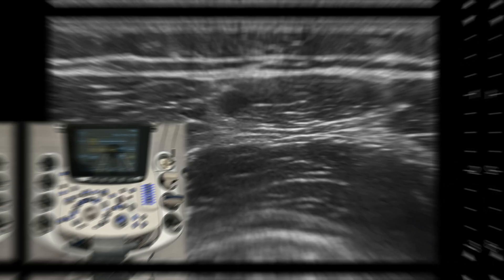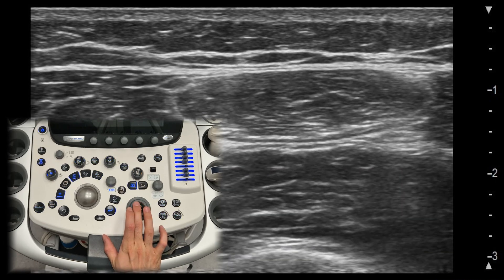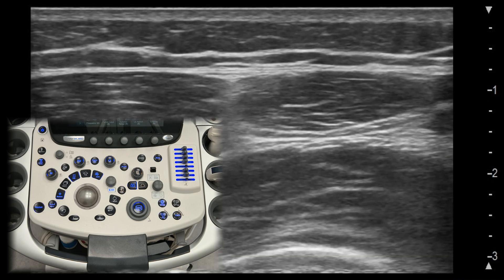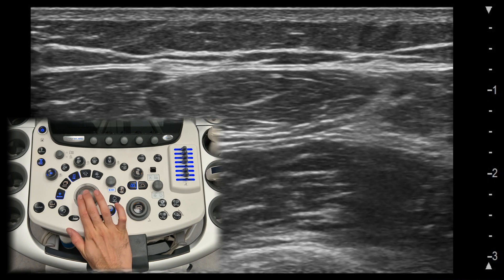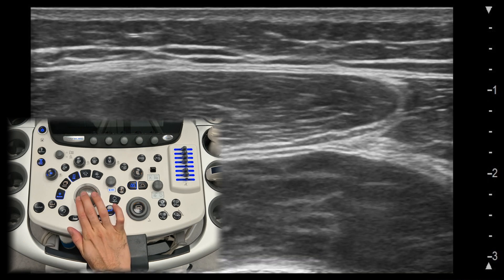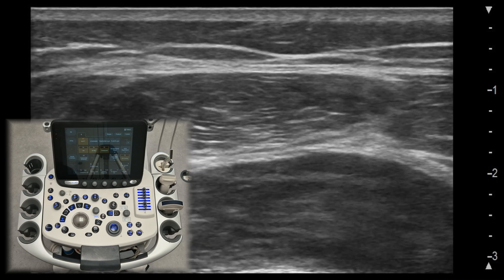Freeze button. The freeze button is like hitting pause on your ultrasound image. It stops live scanning and freezes the current image on the screen. You will use this often when you want to take a closer look or save an image. To review previous images, use the trackball to scroll back. Once you press the freeze button again, you can resume real-time scanning.